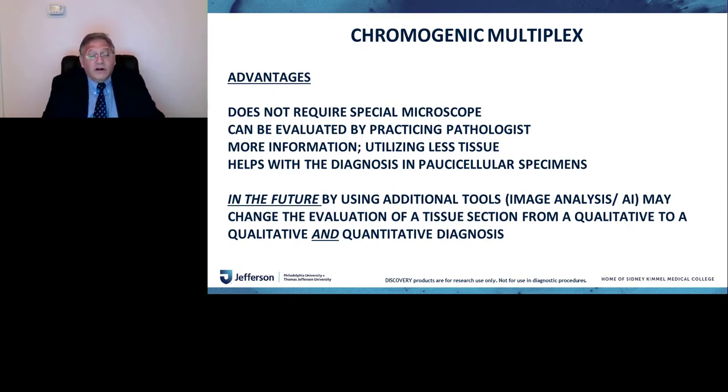In the future, the future of pathology, if we think about it, is going to become digital pathology. There are many ideas about this, and there is a lot of talk about this. In 10, 15 years from now, or some people actually say less, we're not going to have a microscope.